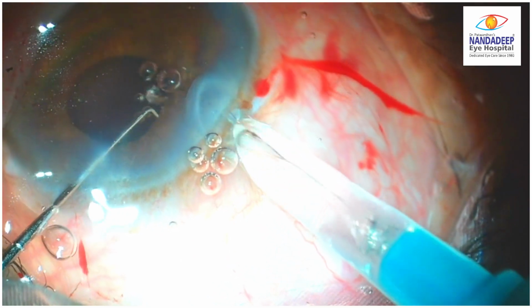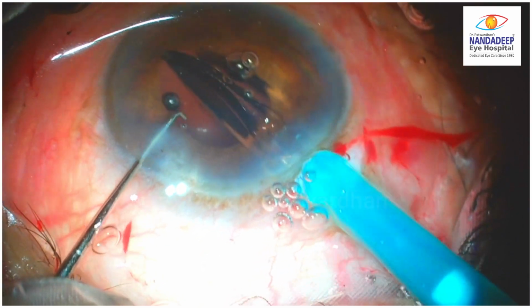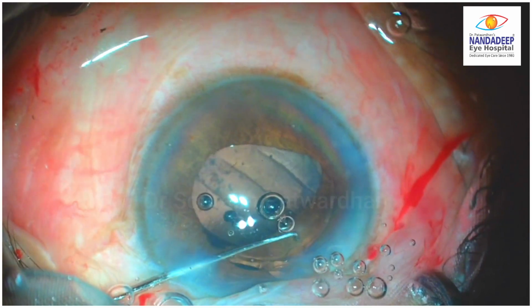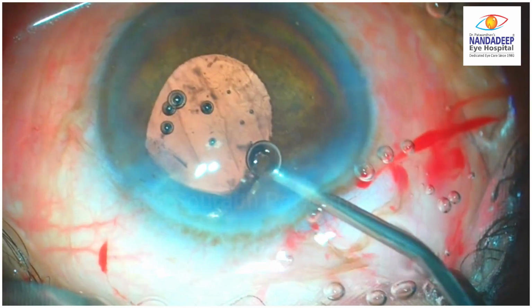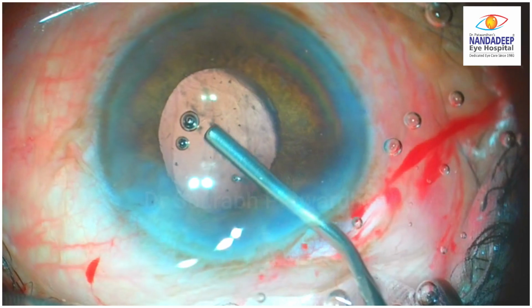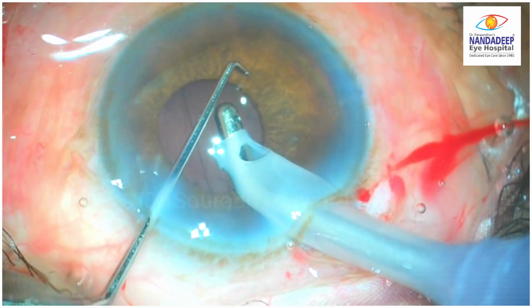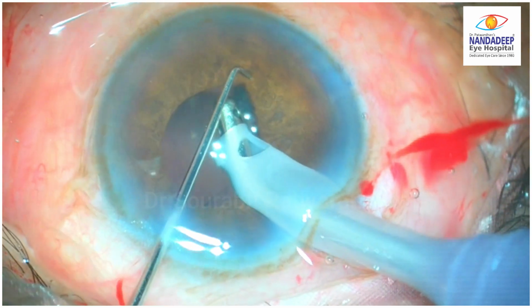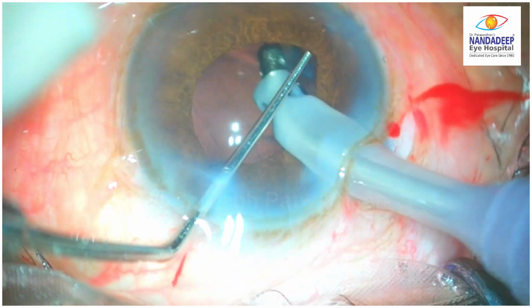So now the IOL goes in. At this point we could have applied maybe iris hooks to see further, as the pupil was not dilating well, but here the senior surgeon is operating now, so making sure that the IOL goes into the bag. Now because of the fluid misdirection, the previous surgeon had not attempted any cortex removal, so the senior surgeon decided to remove the cortex, now retracting the pupil all around, and that was completed without any problem now.